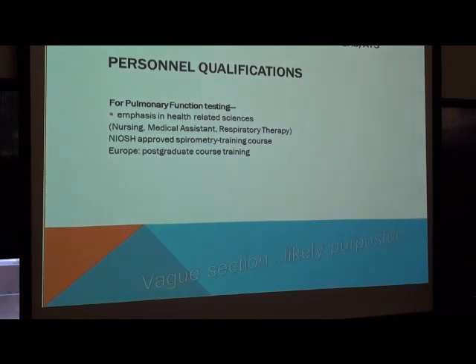Okay. Yes? Do you guys use the CF precautions that we've been starting to initiate upstairs? Oh, you betcha. Gown and glove? Yeah, in addition to that, that room is no longer used for testing until a half hour has elapsed after that patient's departure.